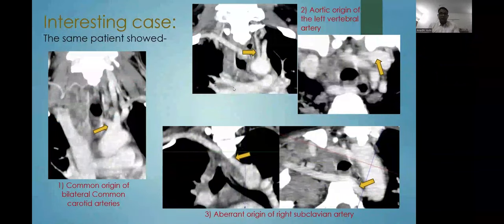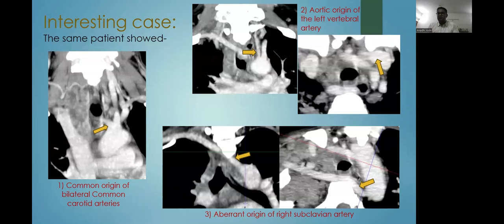We had an interesting case in which, marked in yellow on the left side, we see a common origin of bilateral common carotid arteries. On the top right we see the aortic origin of the left vertebral artery, and on the bottom right an aberrant origin of the right subclavian artery — all three findings in the same patient.